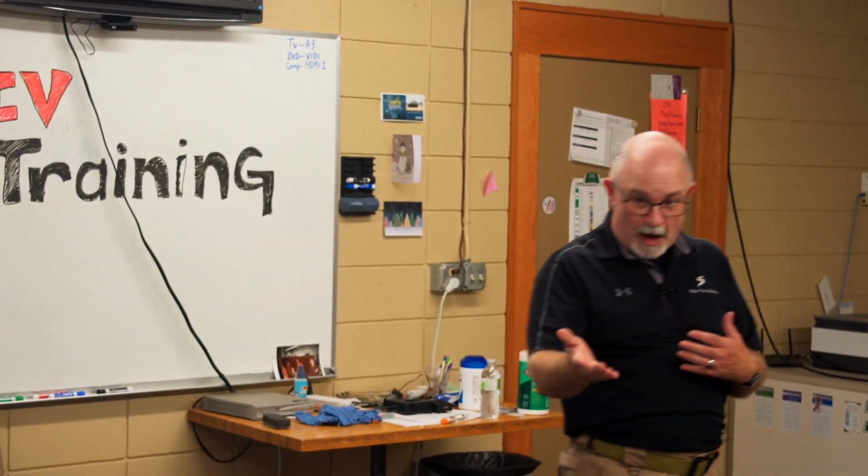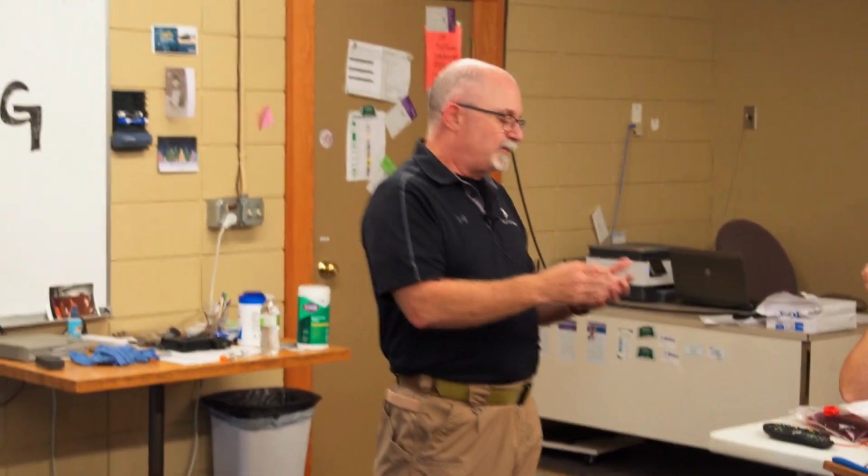So one of those concerns had been, and I wouldn't change right now, but in the most dire of cases, we're a part-time ALS, we have 3 paramedics that float in and out, but with the D10 and IO, even the most critical of patients that if we can't get IV access, we could still do D10 through the IO in an extreme. You have to have a good conversation with your medical director about that.